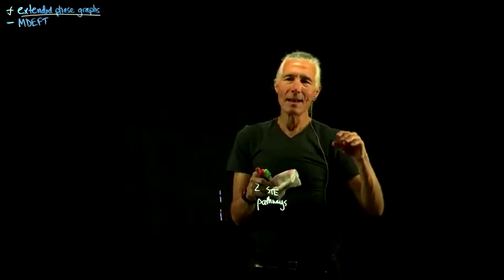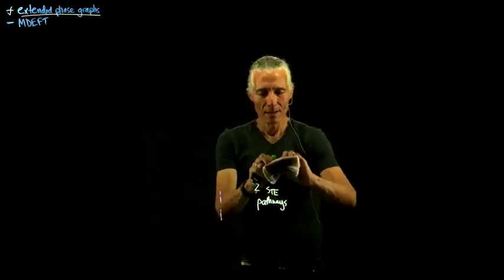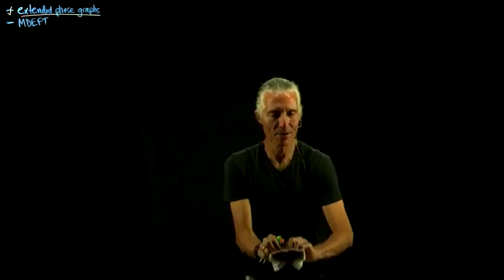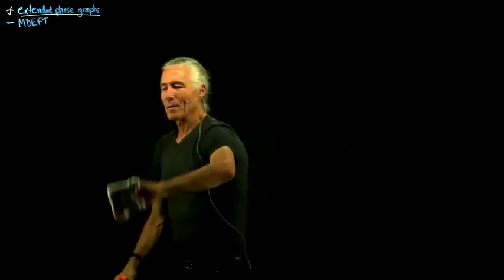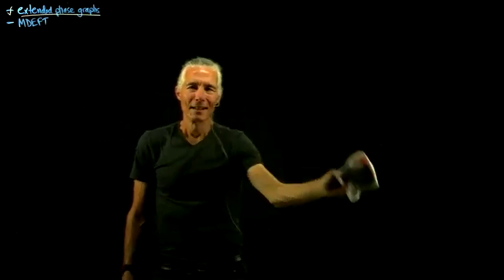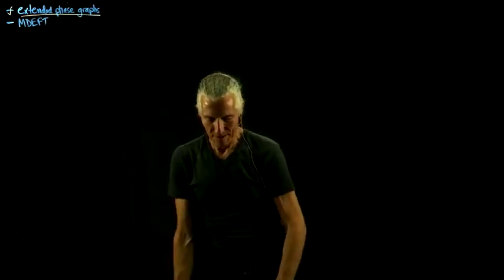So we did some pulses and we've got some magnetization, but we want to get rid of it now because we're going to start again really quickly. If you're trying to design a pulse like that to clean up the room before you start another data acquisition, you have to consider all the pathways that it's creating. And so that's another thing that these graphs are used to design.